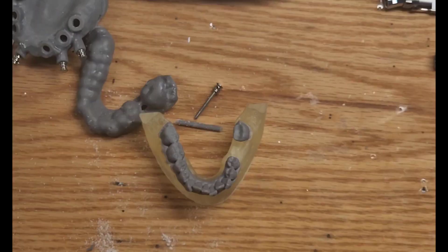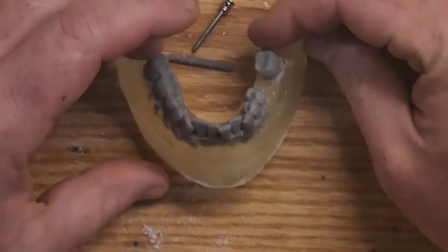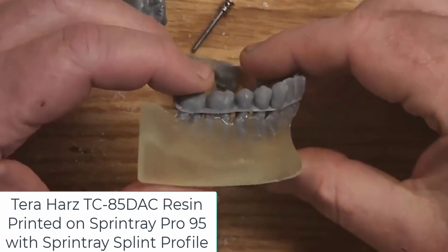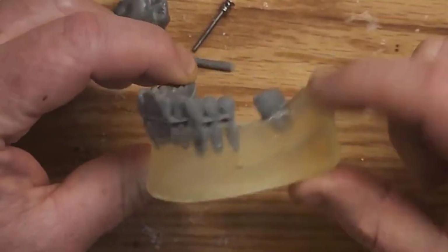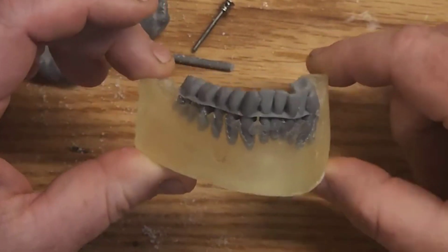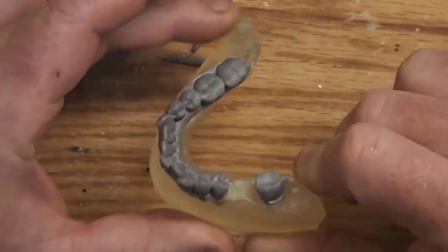Okay, I'm going to do a little voiceover here because the audio had an issue, but what you're seeing now is the completed models. I printed the jaw in that clear resin, which is a softer resin that you can actually drill into, and I'll put the part number up on the screen here so you can purchase that if you want to. And then the teeth have been printed in model resin. We just syringed a little bit of the same clear jaw resin into the sockets, pressed the teeth down into it, and then cured them together.